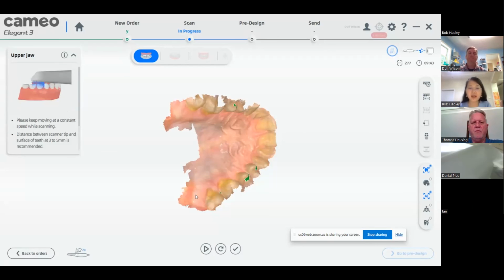Okay, thank you, Duff. And Paulo asked, to print models, do you have any specific settings? Duff has answered this. Well, I'll say for a printed model, this has nothing to do with the intraoral scanner or what scans you get, but to print a model at our office, we print hollow models, and they all have to be 3 millimeters thick.